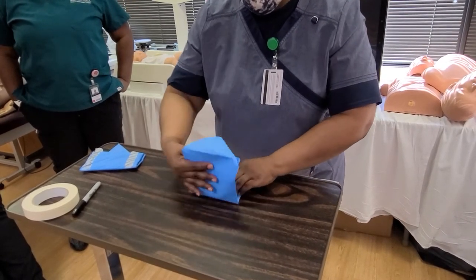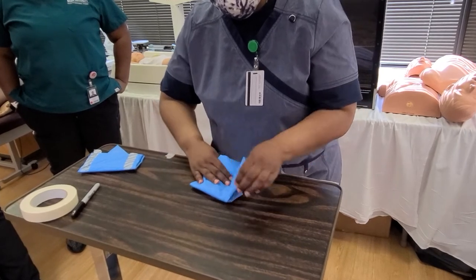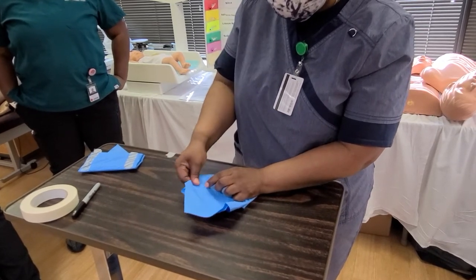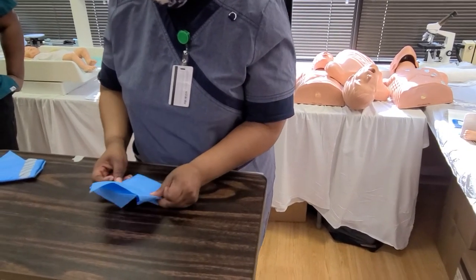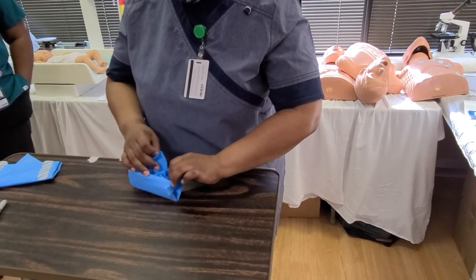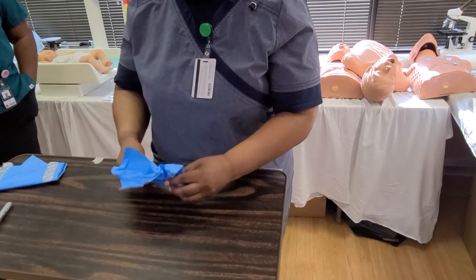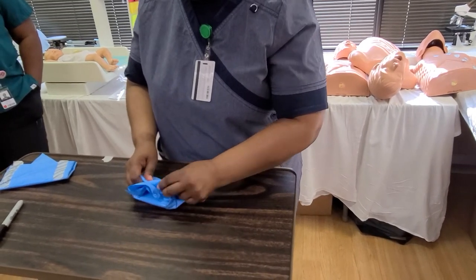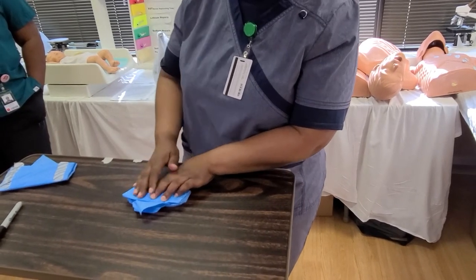Some people fold over, but I always like to bring this back a little bit, bring it towards me, and turn it around. I can kind of push the edges in so it's a little cleaner. Then I'm going to tuck this in again, make it a little neater. So that's going to be my first flap when I'm opening it.